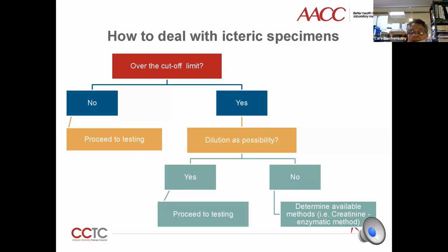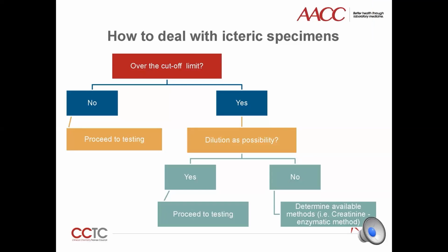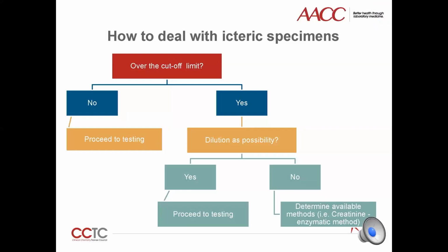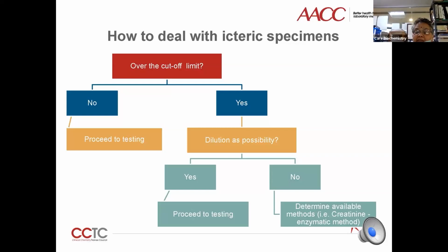Is it true that you should have a different type of a smaller system like a spectrophotometer or a semi-automated system where you can use a blank? I would humbly like to say that many times we use blank samples. Many of my colleagues in the city, you have a semi-automated in your lab, you have a spectrophotometer in the lab, maybe it is old school of thought, but these instruments do help us overcome many problems. Blanking does not help all the time, I accept, but blanking on these simple instruments has helped us many a time to come nearer to the reading nearer to what it should be.